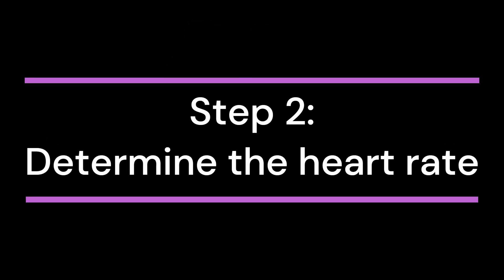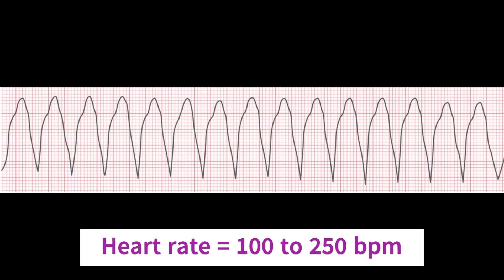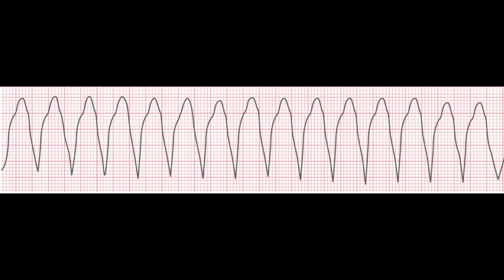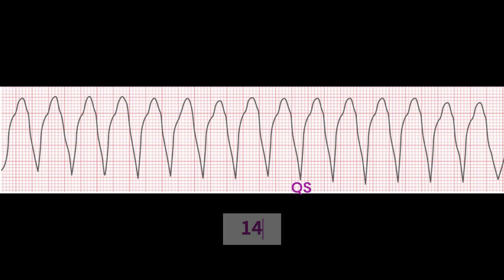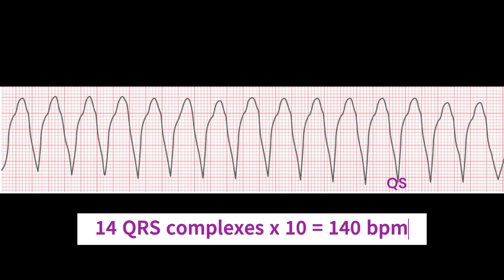Step 2: Calculate the heart rate. The rate of VTAC can vary, but it is usually between 100 to 250 beats per minute. In this example, we count the number of QRS complexes, or rather the QS waves, in this 6-second section, then multiply that by 10, and we get 140 beats per minute.